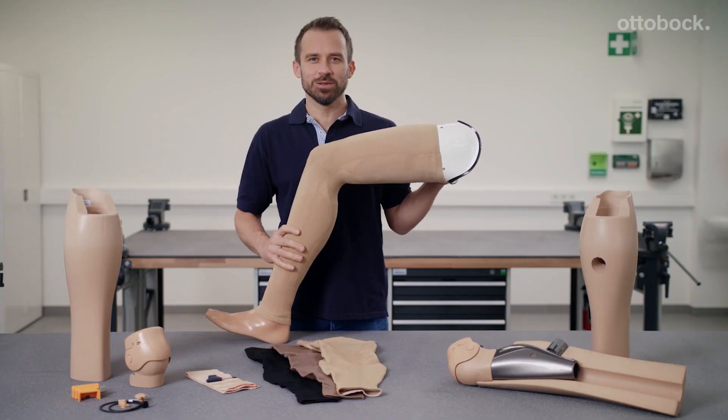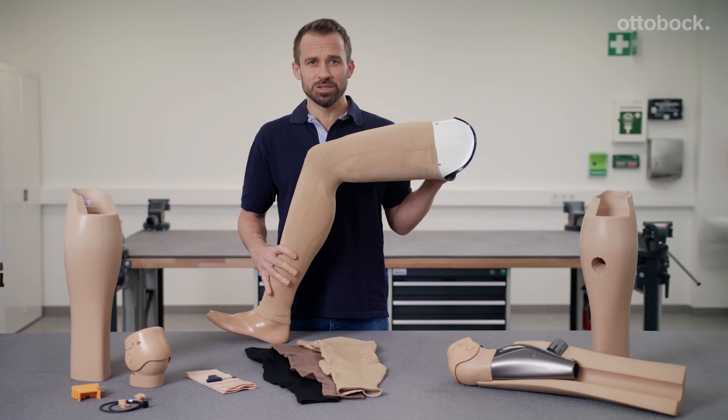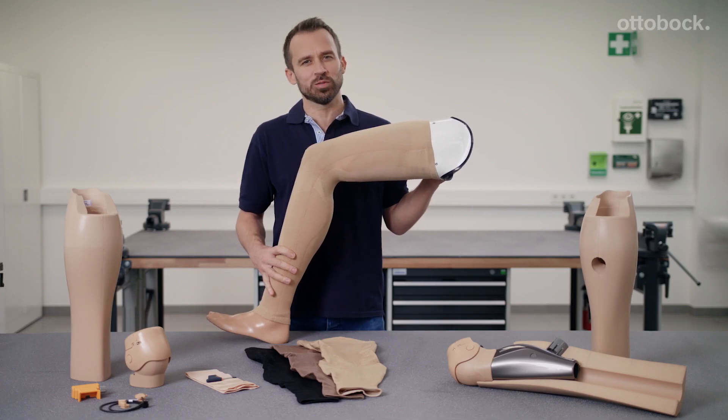Hello, my name is Thomas Hainaut. My goal is to help prosthesis wearers look their best in addition to achieving the highest possible level of mobility.